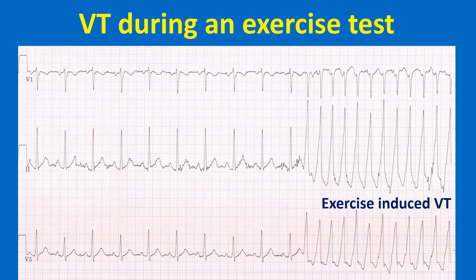This ECG shows VT occurring during an exercise test. It is a monomorphic VT with QRS negative in V1 and positive in lead II and V5, suggestive of RVOT VT.